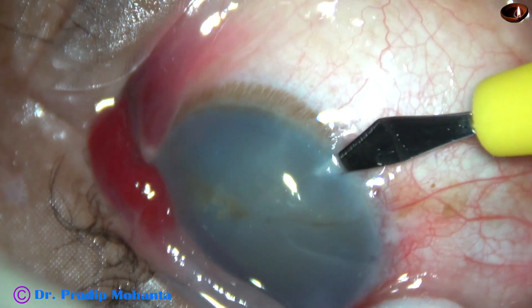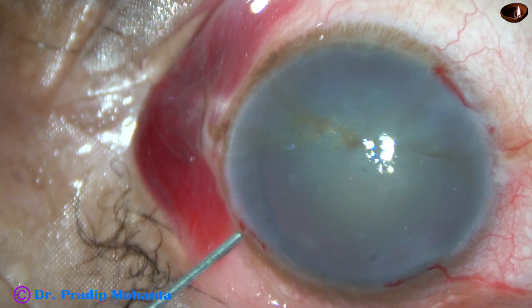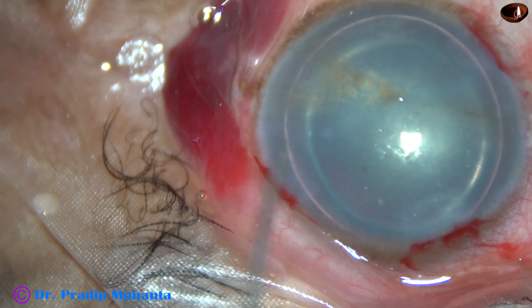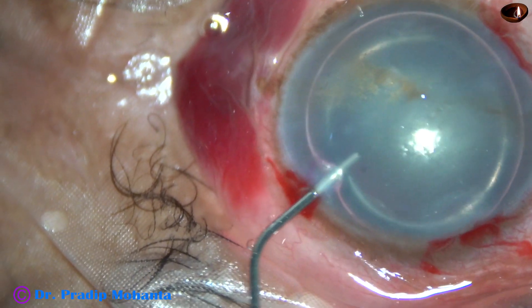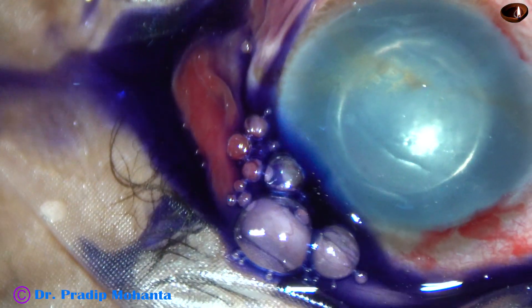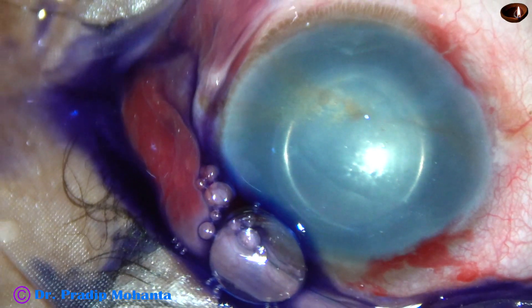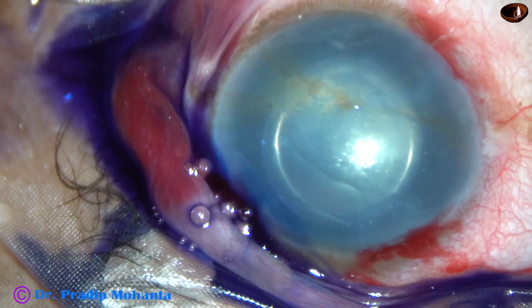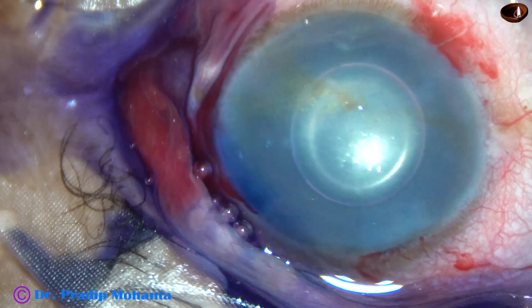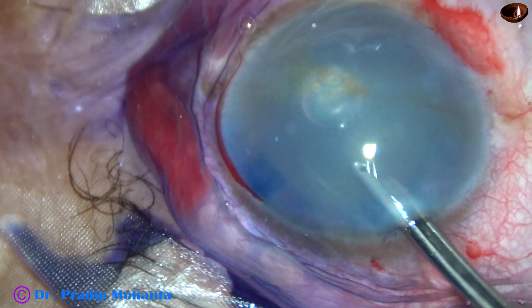The main incision and two side ports have been made. And now an air bubble is injected to fill up the anterior chamber. Beneath this air bubble, trypan blue dye is applied over the anterior capsule of the cataractous lens. Let us see if visibility improves with the dye. The dye is washed out, and this is a bit of adrenaline. The dye is washed out using balanced salt solution.